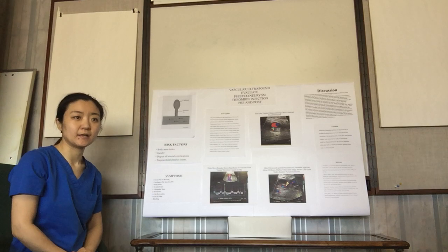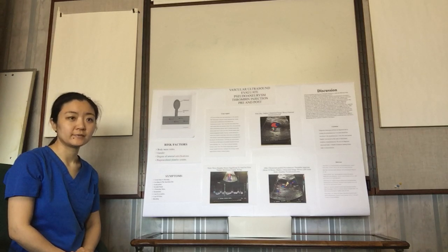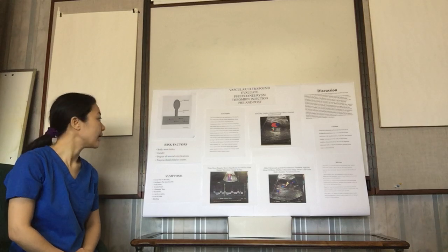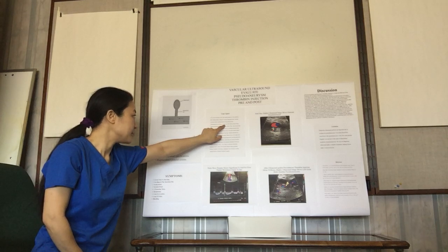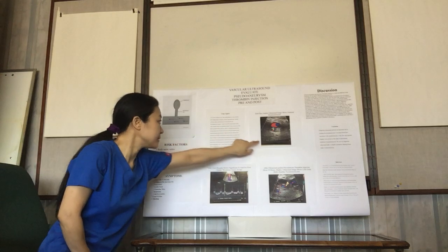There is a patient, she is 91 years old, female, with a past medical history of CAD. After her heart cath, during the vascular ultrasound exam, the vascular ultrasound tech detected a pseudoaneurysm in her left groin area. The pseudoaneurysm measured 1.9 centimeters times 1.3 centimeters, with the neck measuring 0.4 centimeters.